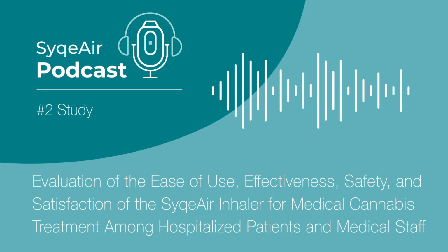That makes sense. Exactly. And it highlights the importance of considering the source and quality of cannabis, particularly in a medical context. Right. And this study wasn't just about making cannabis available in hospitals. It was about integrating it into a formalized treatment plan. Precisely. And that's where the metered dosing aspect of the SyqeAir inhaler becomes crucial. Can you elaborate on that? Sure. In this study, each puff from the inhaler delivered 500 micrograms of THC. This level of control allows doctors to adjust the dosage based on individual patient needs and monitor their responses closely. It's like the difference between taking a prescribed dose of any other medication versus just estimating a dosage yourself.